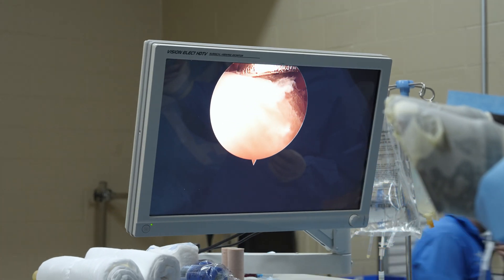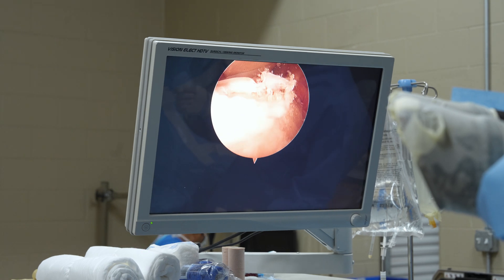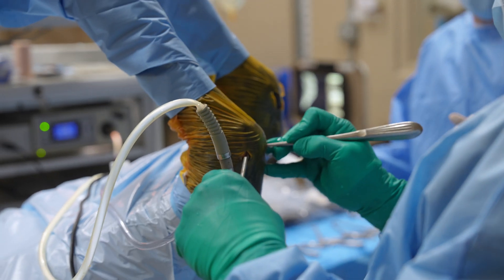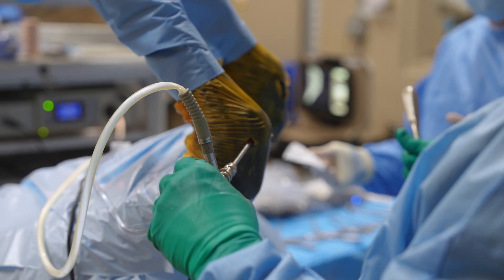We have radiographed before and we know exactly where that fragment is. So what the surgeon is doing — with the highly skilled technique that he has — is going in and putting the camera in one side of the joint and the instrument in the other side of the joint. That's called triangulation.